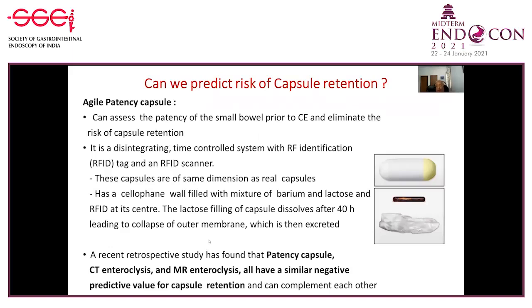The study has found that the patency capsule and CT enteroclysis have a negative predictive value for capsule retention. Patency capsule is not much used in our country because of the cost. Make use of MR enteroclysis if you really need to check. Capsule aspiration is another rare complication.